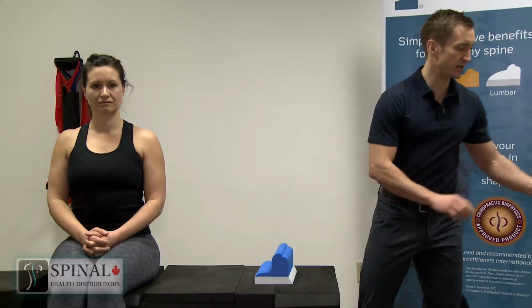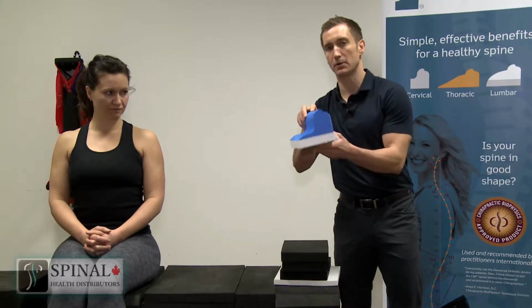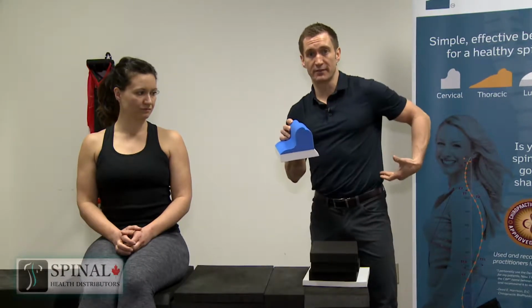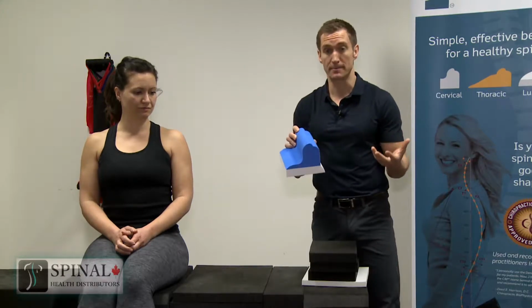So we'll pretend here that our patient has a left lumbar scoliosis. We want the peak of the lumbar roll to be at the peak of the curve, so wherever the apex of the curve is on X-ray. Now most of the time, this is going to fit inside the fleshy part of the hip here, and the peak will hit L2, L3 automatically.